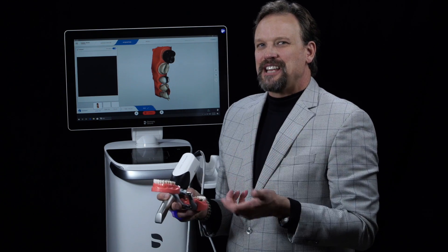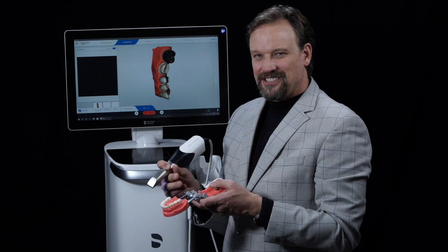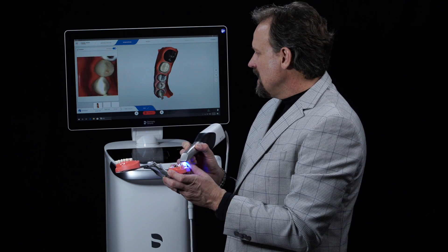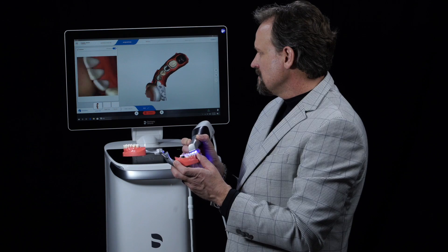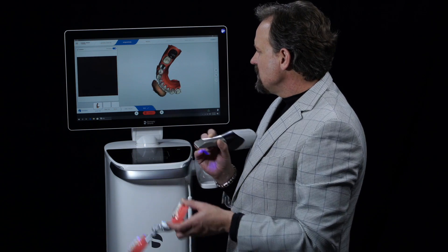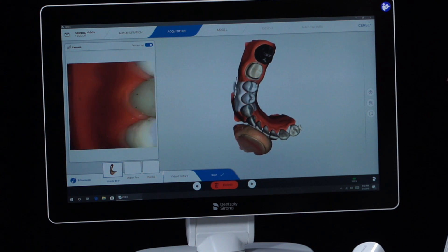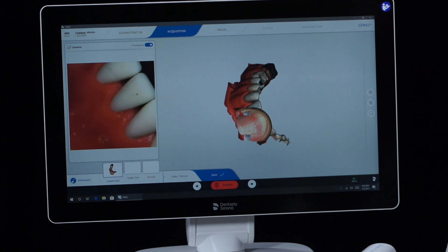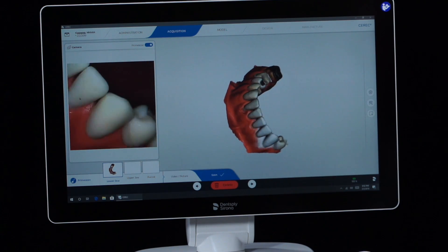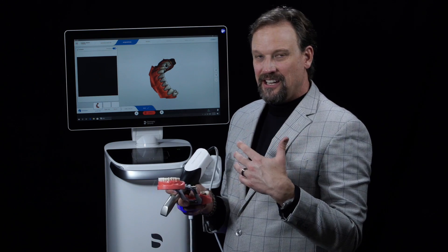One thing that happens when scanning in the mouth is that cheek or lip gets in the way — things are moving. What's neat about the new data processing is it actually kicks all that stuff out. I'm going to pretend my thumb is the lower lip and get it in the shot. Once I move it away, the camera recognizes the lip is gone and starts erasing it. That means when you're scanning, if you catch a bit of lip or tongue, you don't have to stop — just keep scanning and it will work it out.